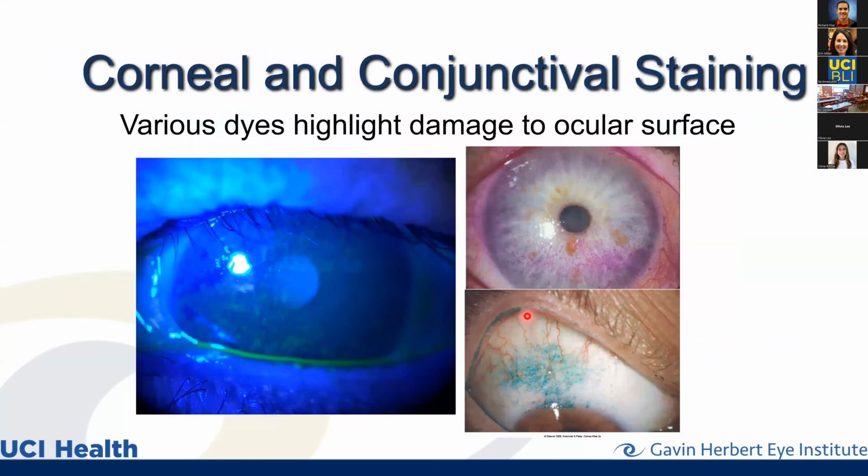If this is severe enough, goes on long enough, you will have these areas of staining. We call this fluorescein staining on the cornea. These little green dots are highlighting areas where the corneal epithelium is damaged and or missing. So all of these little green dots, we tell the patient these are little micro scratches that have occurred, not because you scratch yourself, but just because the air is passing by your cornea and you don't have adequate tears to protect your eye from that damage.